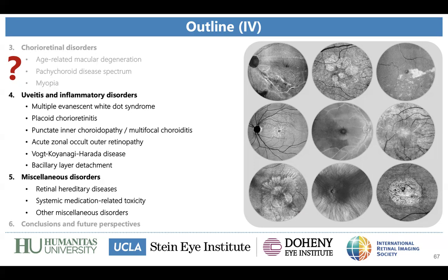So to follow atrophy, and Dr. Rosenfeld has been saying that for about 10 years, en face OCT is much better, and we will have to learn how to use en face OCT for atrophic AMD.